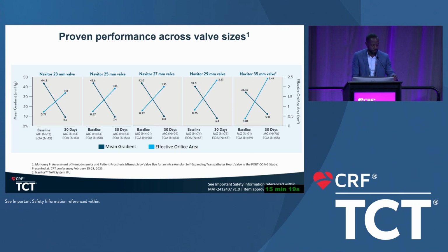And how much does it add to surgical risk? If I have a 70-year-old low-risk patient who needs an AVR, it adds zero. For me, it doesn't add anything, but we do a lot of them. For an average surgeon, it does increase about 25 to 30% odds ratio to 30-day outcomes, not overall outcomes.